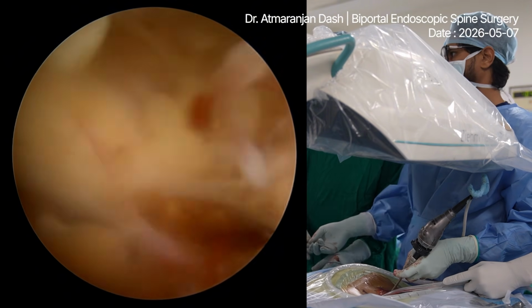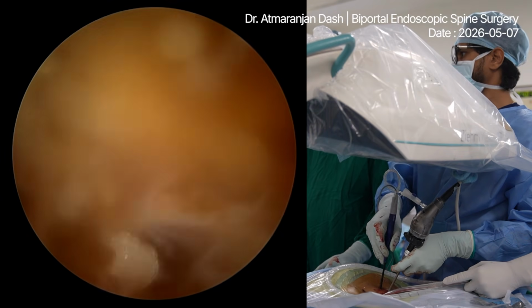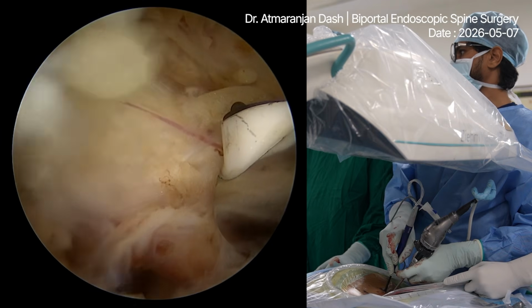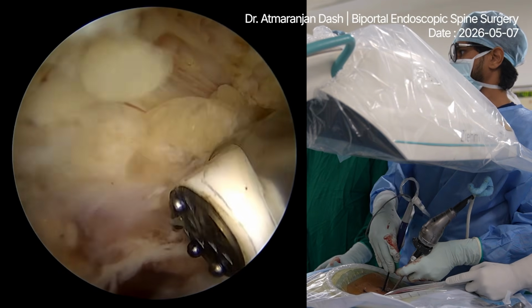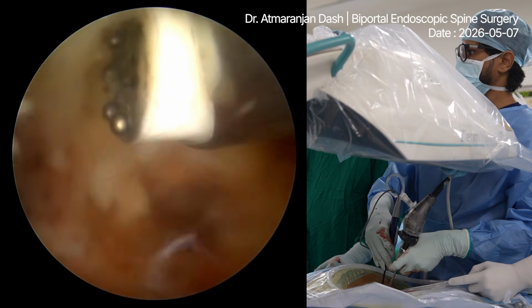Coagulation. Saline. Coagulation. Stop. Coagulation.